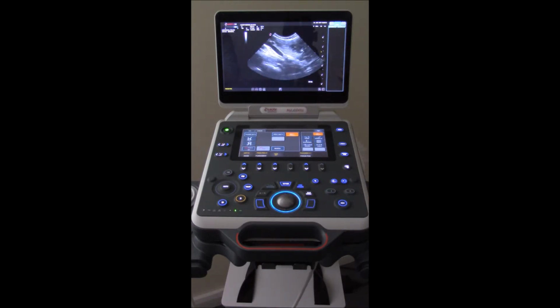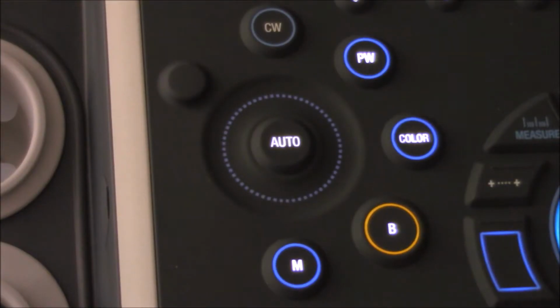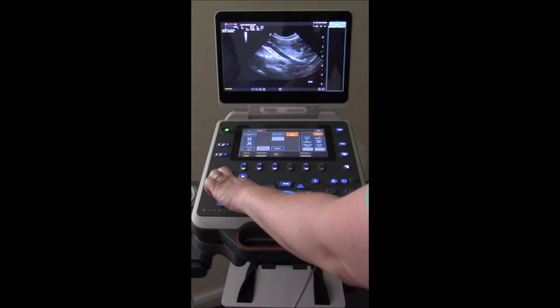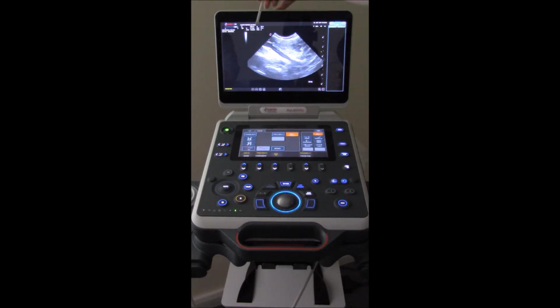The last 2 things we're going to talk about are the overall gain and the time gain compensation. So our overall gain is this dial here, and just by moving your finger clockwise and anti-clockwise over the dial, you can see that the image is getting lighter and darker. We also have a percentage gain up here that just shows us where we are.